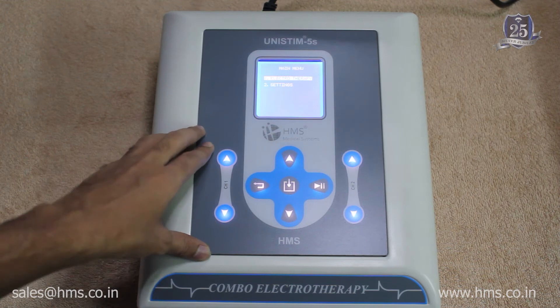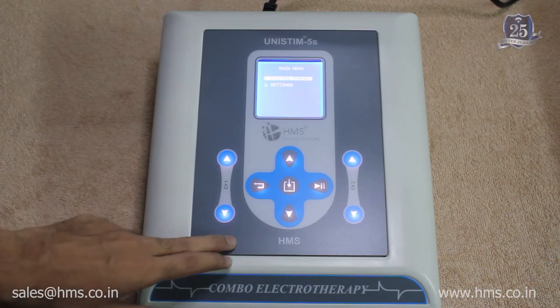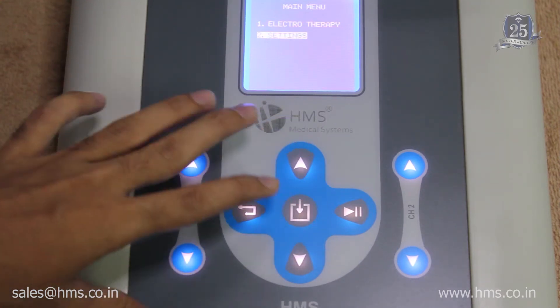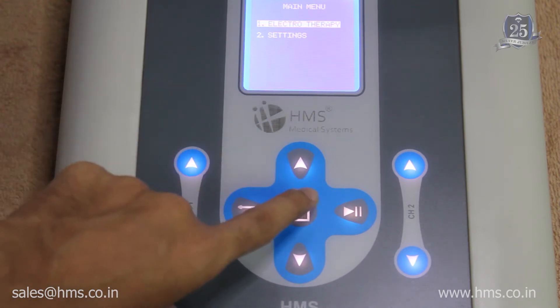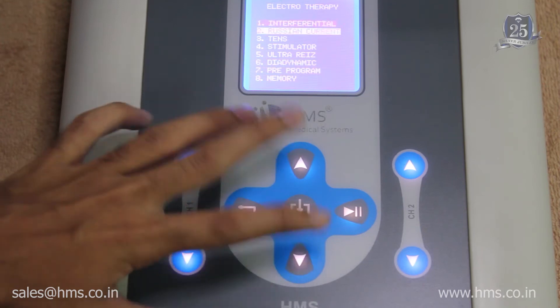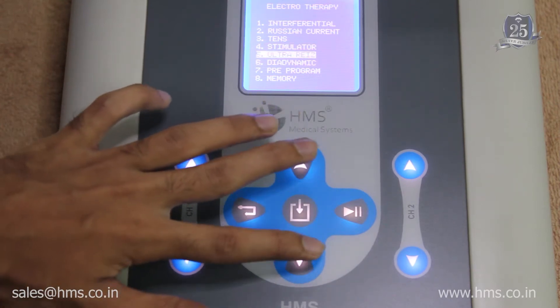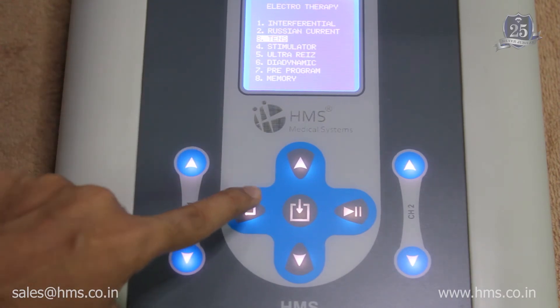It might seem a bit confusing, but it's very easy to use. The two keys at the top and bottom are used to navigate through the menus, and the middle button is the select button. After selecting electrotherapy, you can navigate its menu using these top and bottom buttons. All these keys are capacitive buttons, so you don't need to push them, and the button to the left is the back button.